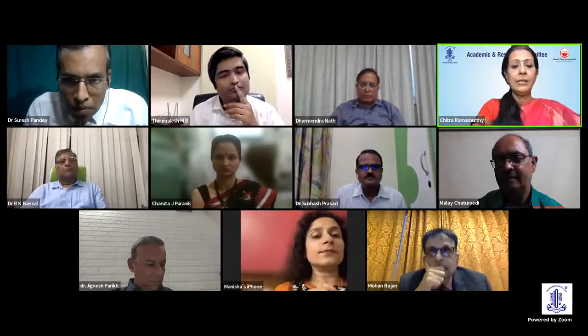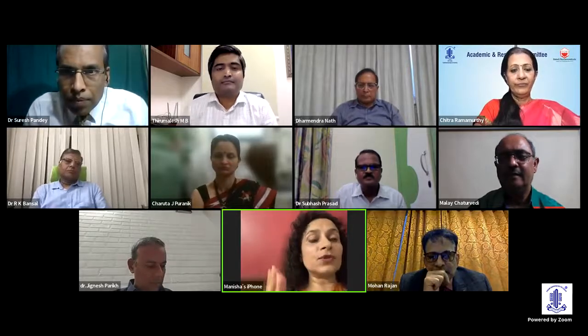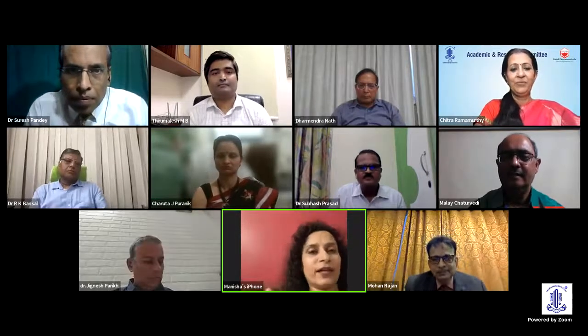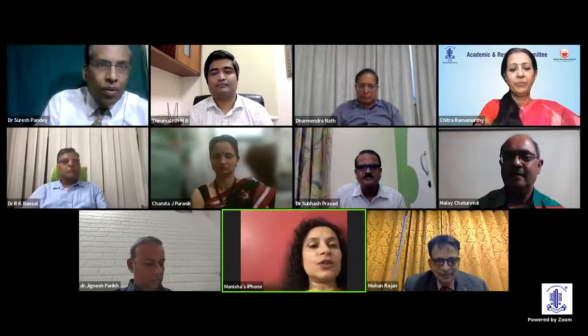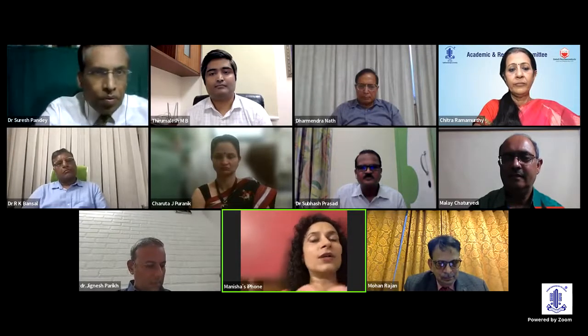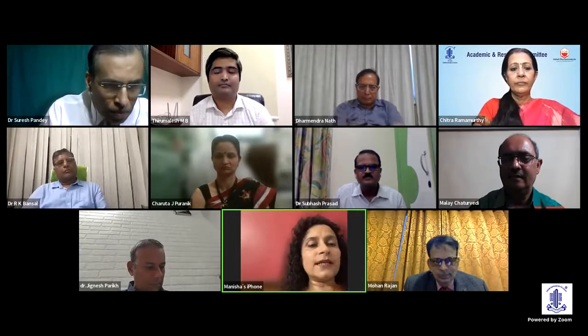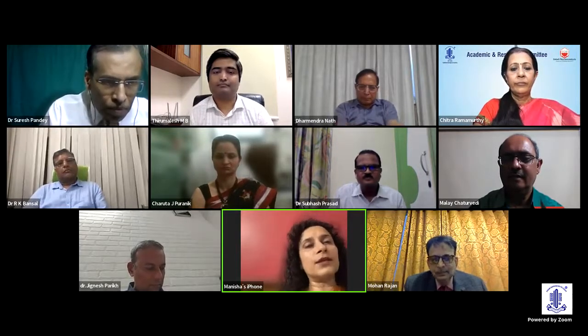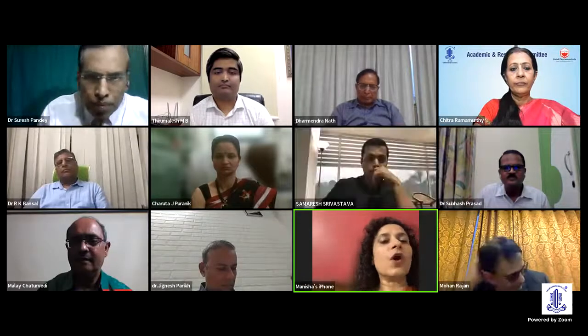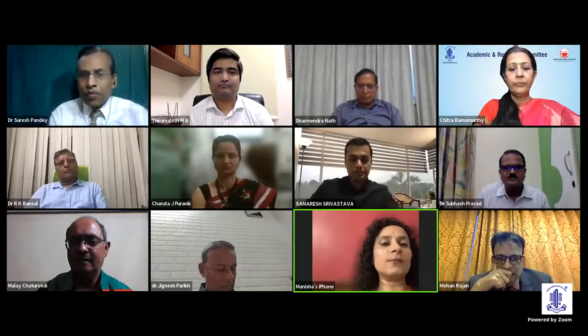You have to unmute yourself. Oh, sorry. First of all, thank you very much, ma'am. This was a wonderful video. Only a master could have done this. I was wondering, even when I was watching, this reverse optic capture was very difficult. And like you said, I was wondering what was the size of the rhexis and what was the size of the optic. So basically, even the post-operative, I would not like to call this patient for a long follow-up. I think a frequent follow-up is more important to check in the post-operative time.